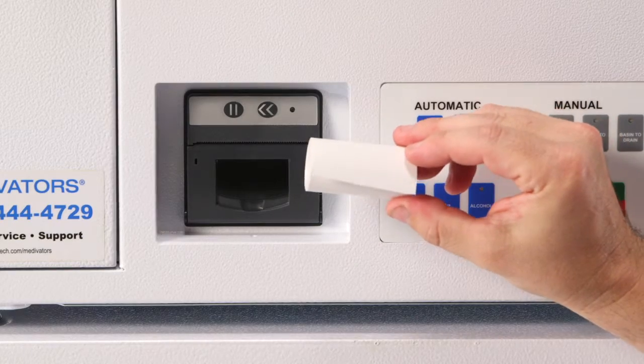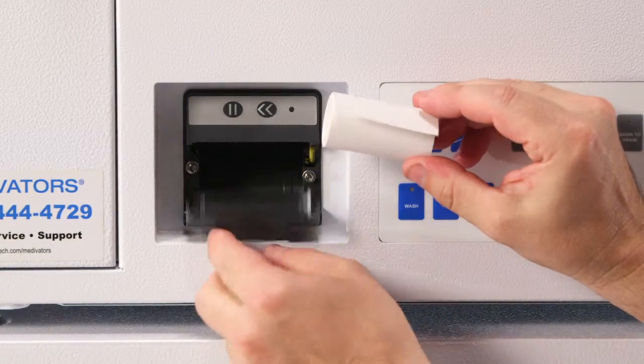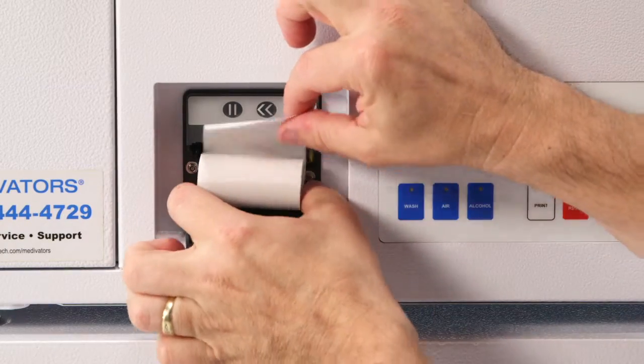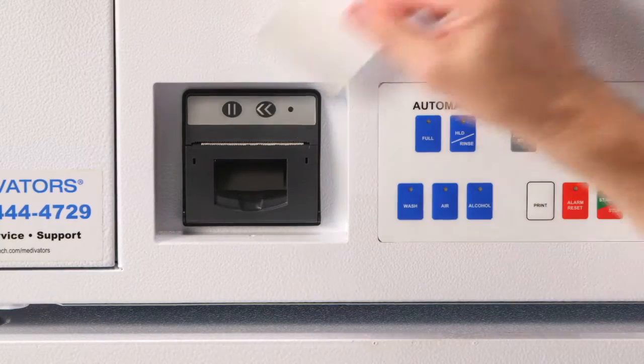Locate a roll of the Medivator's supplied thermal printer paper and load it into the printer. The paper is always installed so that the leading or loose edge of the paper always comes off the top of the roll when coming out of the printer compartment.